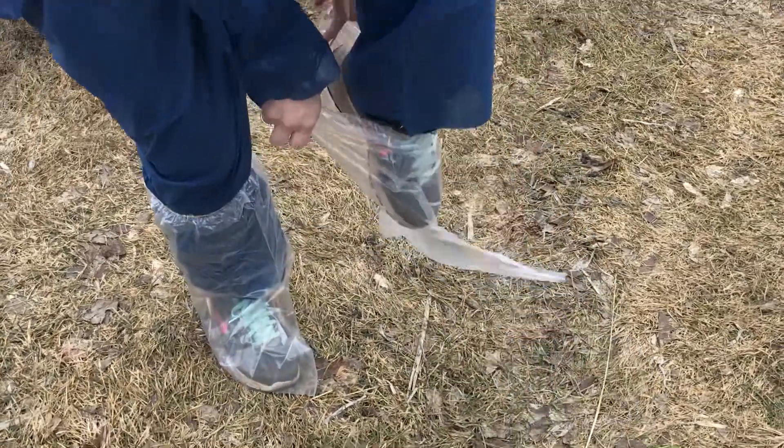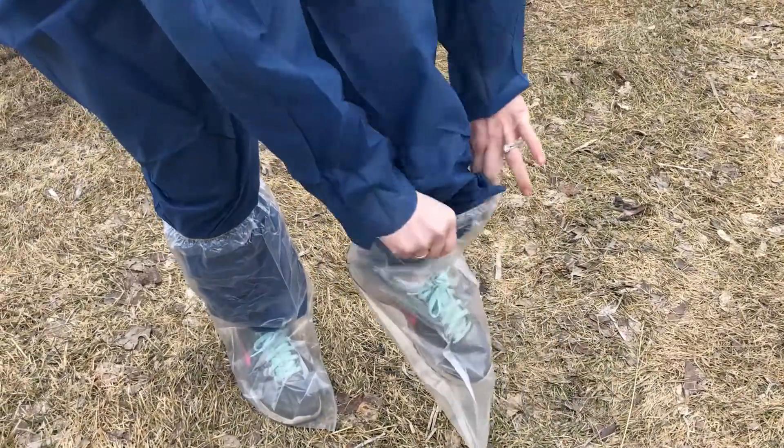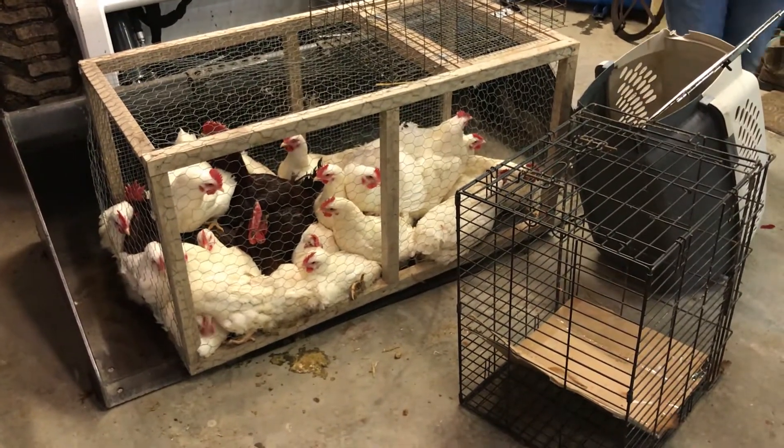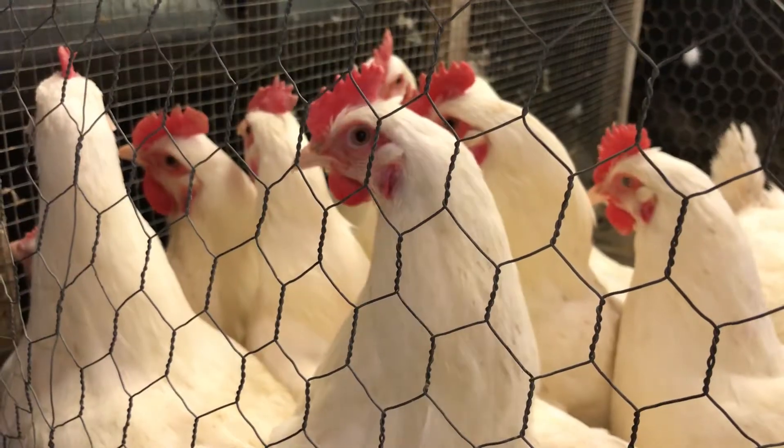This video demonstrates how to conduct the rapid whole blood test for pullorum typhoid disease. The rapid whole blood test can be used on all poultry species except turkeys.